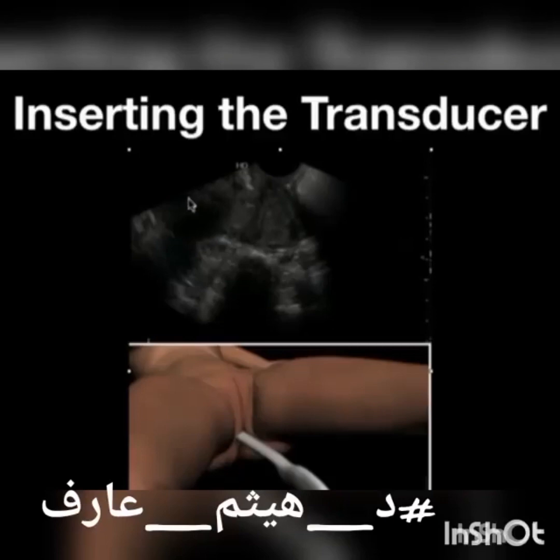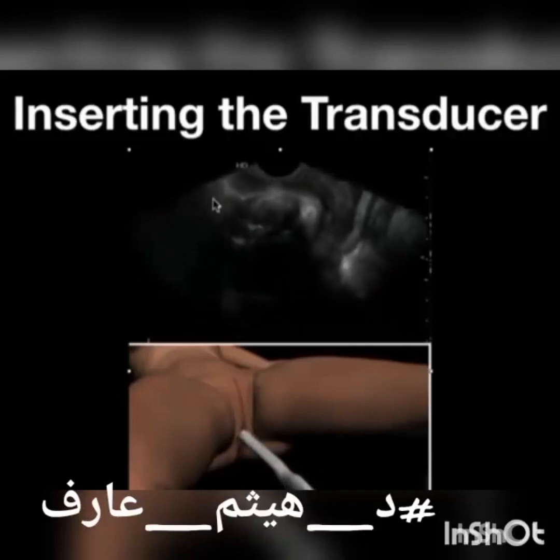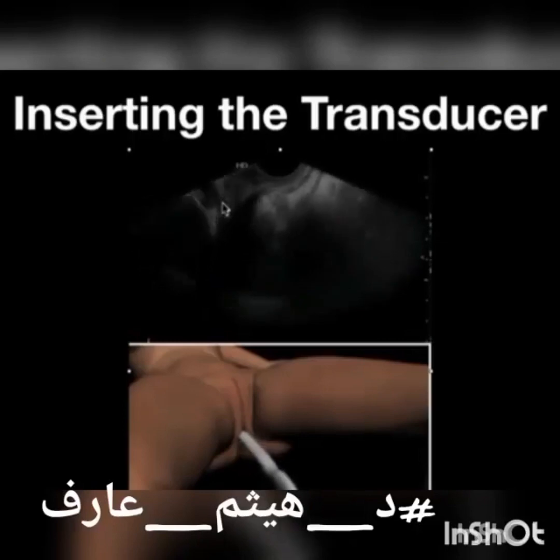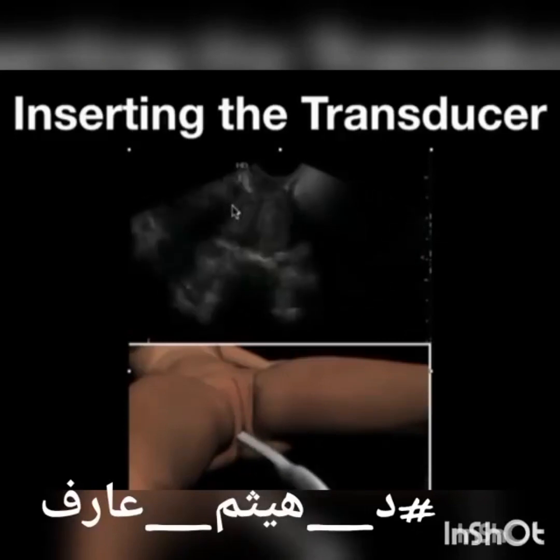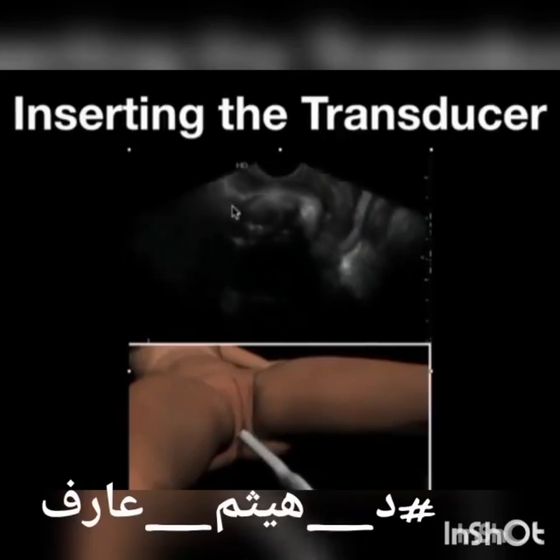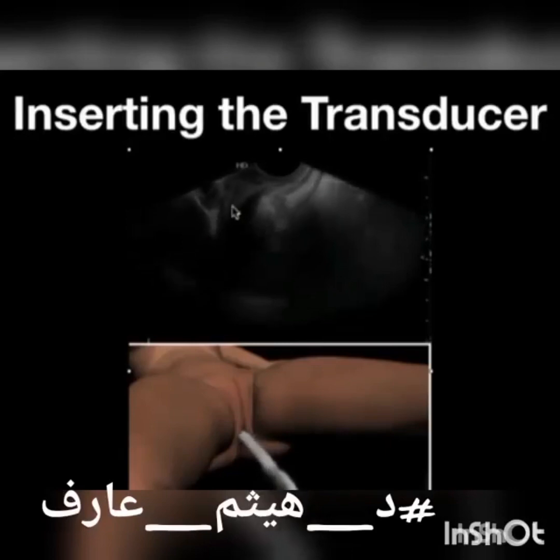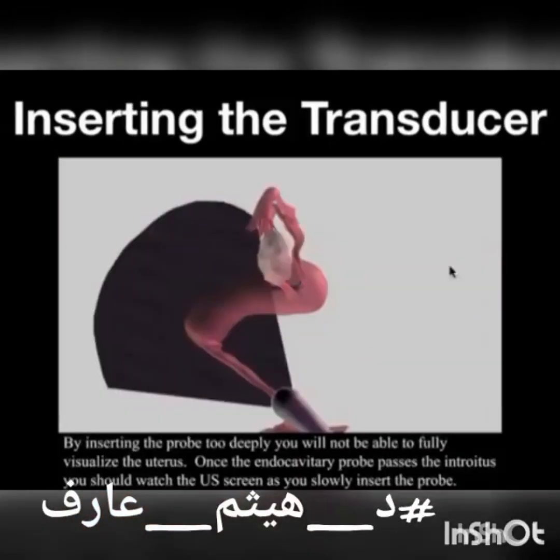Here you've got the uterine fundus. You can see some of the endometrial stripe here. And you can see once the lower uterine segment is recognized, you're able to then go from side to side, as well as angle the transducer up and down in order to bring the uterus into the central part of the screen. Don't perform this exam the same way that you perform a vaginal speculum exam.